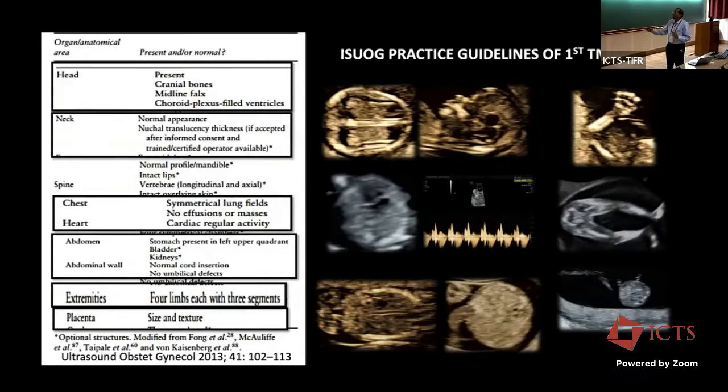Since all these landmarks are very, very standard, for example, this little white mark will always come in all fetuses exactly at the same point. And this is your palate. That little white line is the nasal bone. The other white line is the skin over the nose, and that's the tip of the nose. This is your chin, this is your palate, and this is your midbrain.